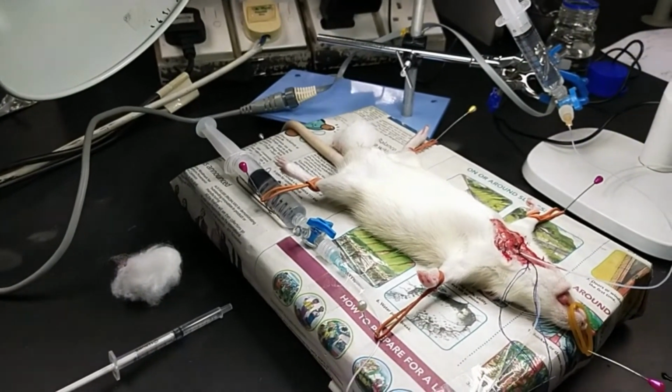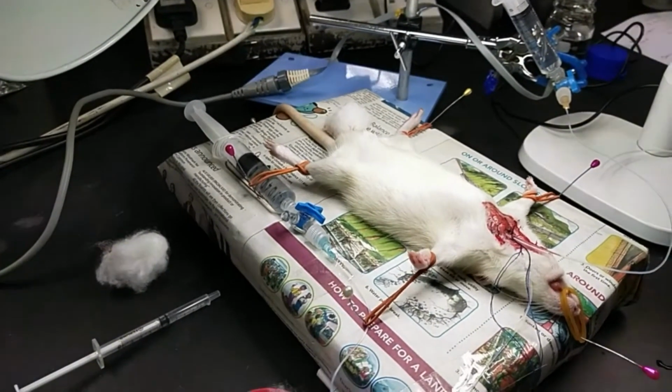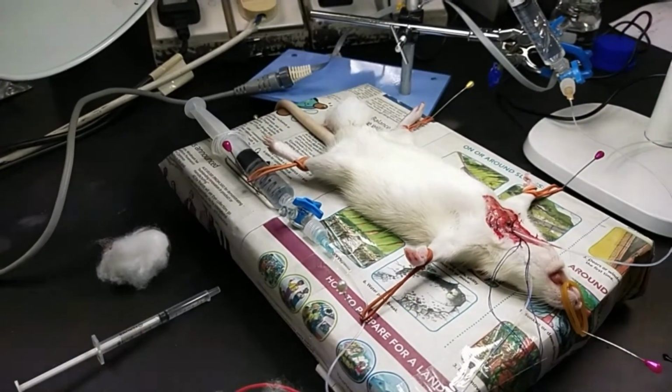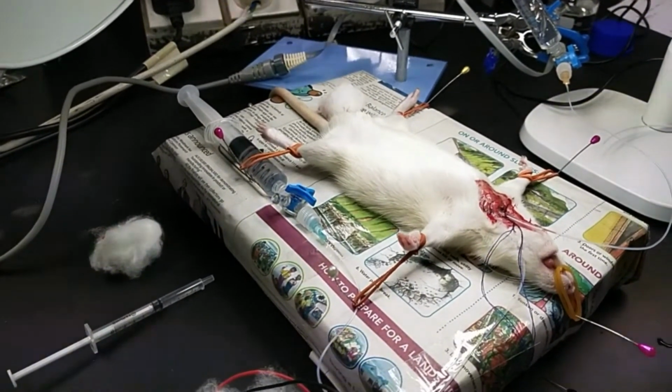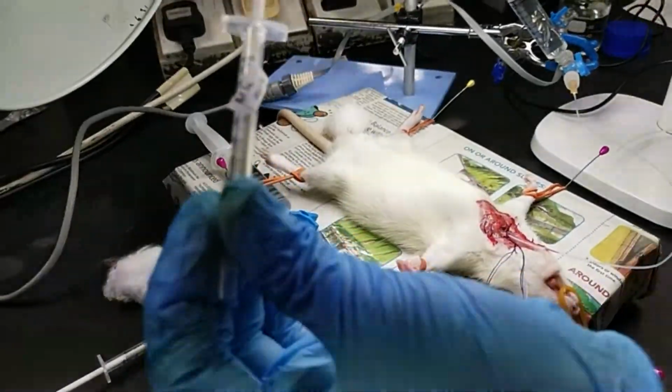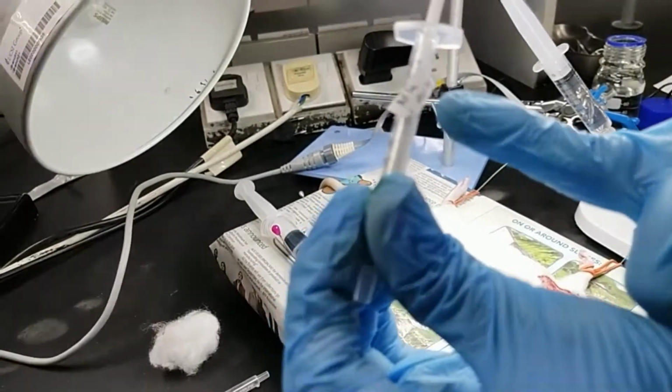So now we're going to proceed with the third parameter, which is the effect of various drugs on the blood pressure. The first drug we're going to introduce is acetylcholine, the low dose acetylcholine. Here we have acetylcholine 1 microgram per kg.